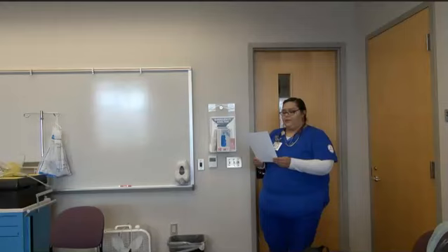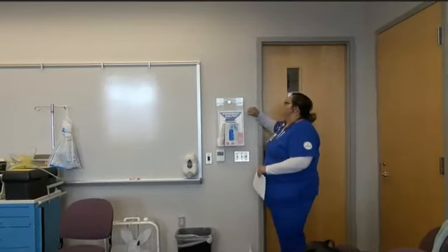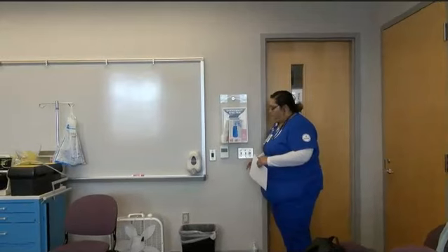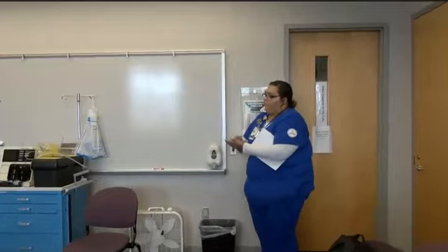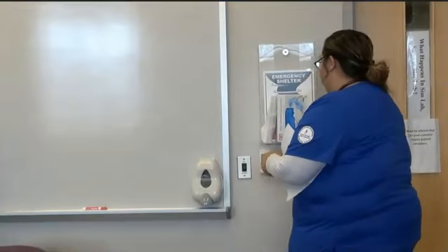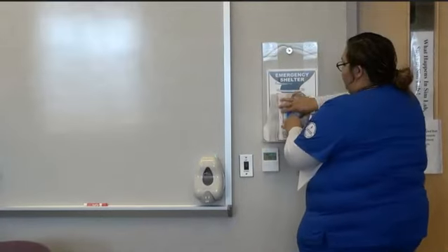As you will notice, the respiratory therapist will knock to ensure privacy and ask for permission to enter. You must wash your hands or use alcohol-based hand rub for hand hygiene and then put on your gloves. As you notice, the respiratory therapist will communicate with the patient.